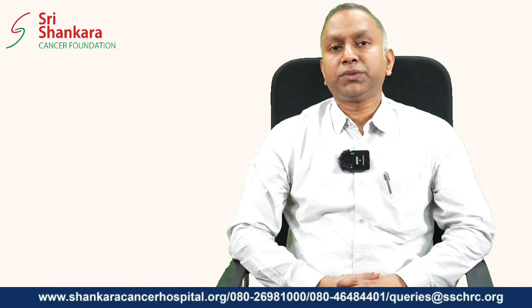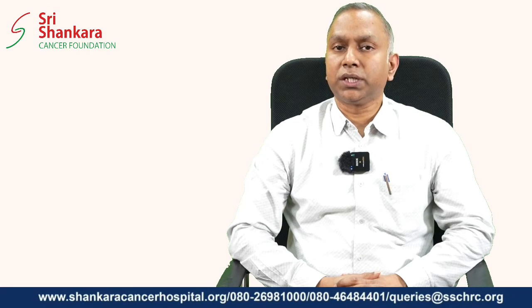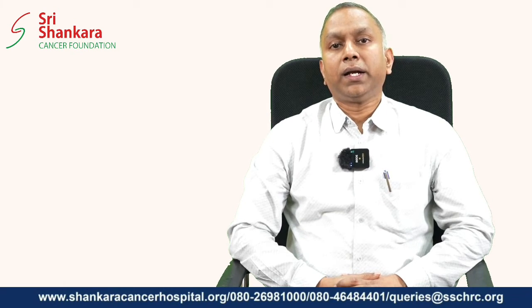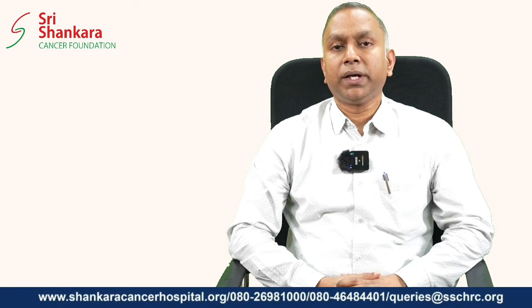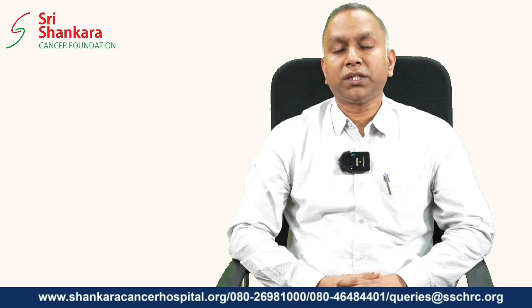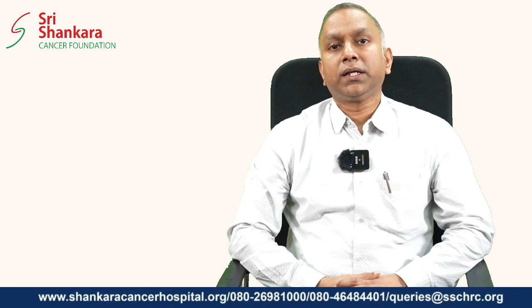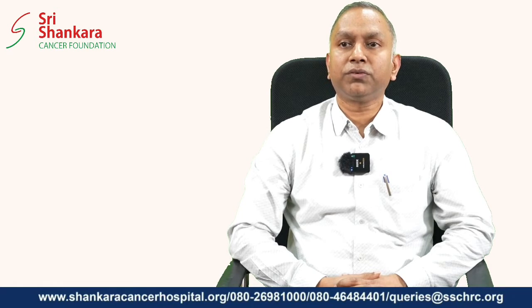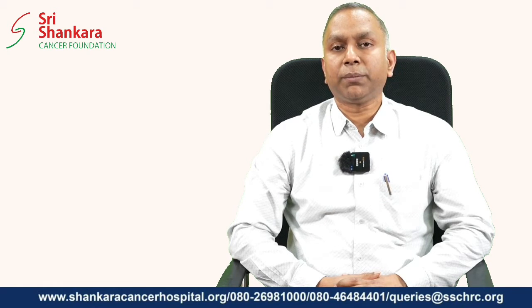Most of the time the brachytherapy procedure is done under anesthesia so that the patient does not have discomfort or pain from the procedure. Examination under anesthesia will be done, and based on the anatomy the patient will be assessed and adequately sized applicators will be placed inside the cervix as well as the uterus, and then the radiation treatment planning will be done. That is the classical example of a combination of external radiotherapy and intracavitary brachytherapy.